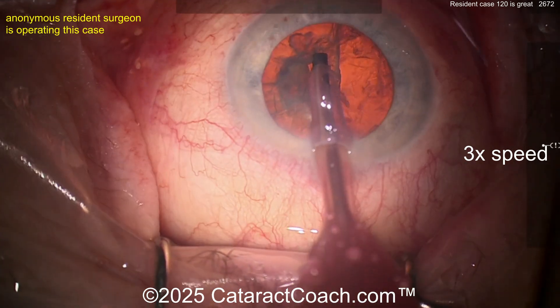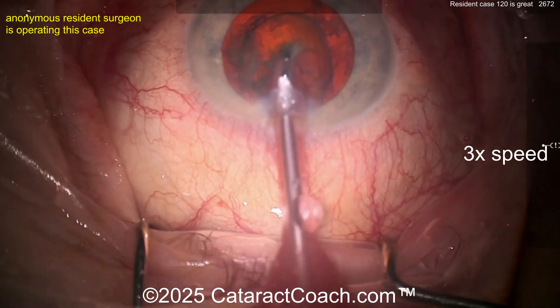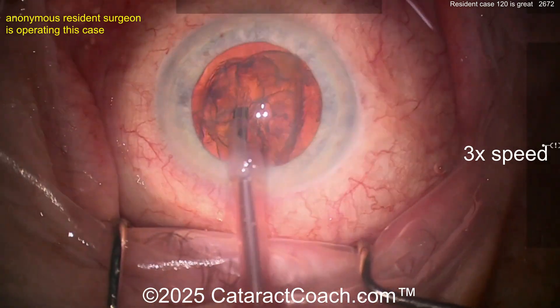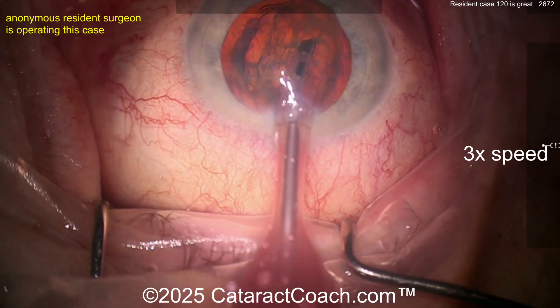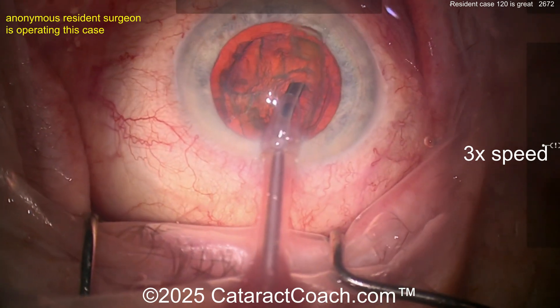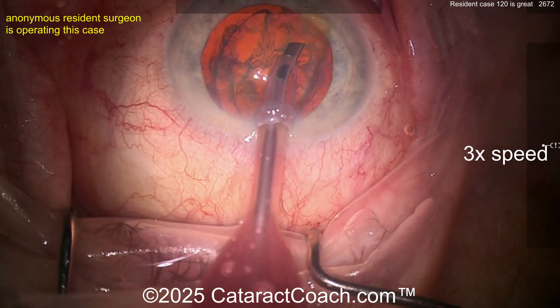Here comes the second quadrant — that looks great. Third and fourth quadrant getting rotated around — take these out nice and easy. Beautifully done. The video in real time was about 15, 16, 17 minutes, which is very good for about case 120. This is where you need to be.